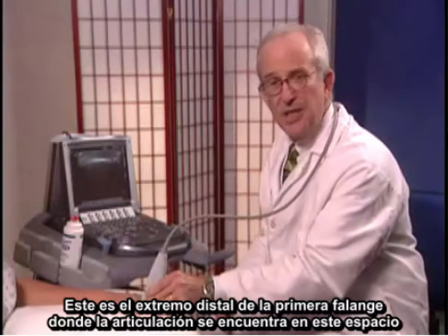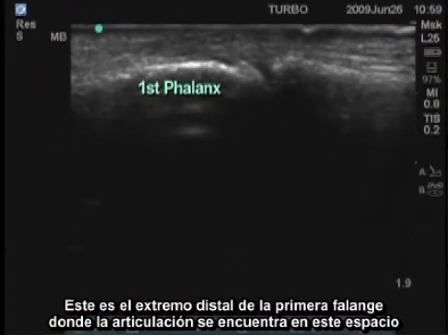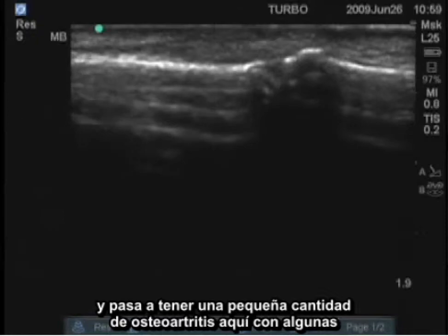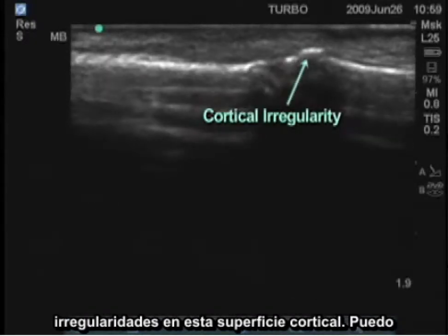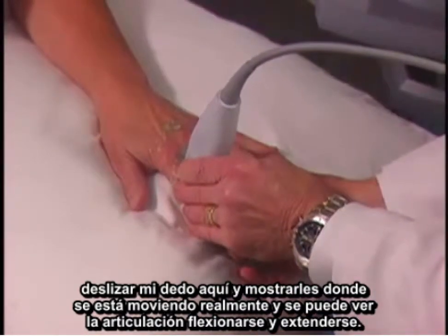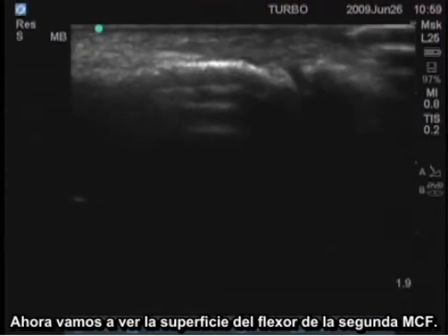We'll look at the PIP. This is the distal end of the first phalanx. The joint is this space here, and she happens to have a small amount of osteoarthritis here with some irregularity of this cortical surface. You can see that joint flexing and extending.